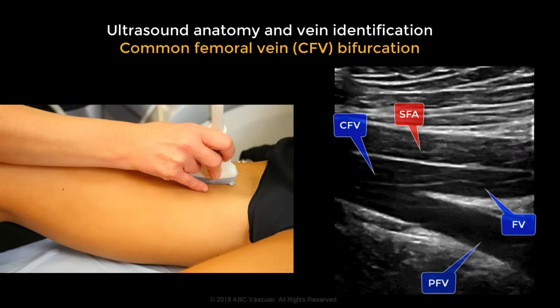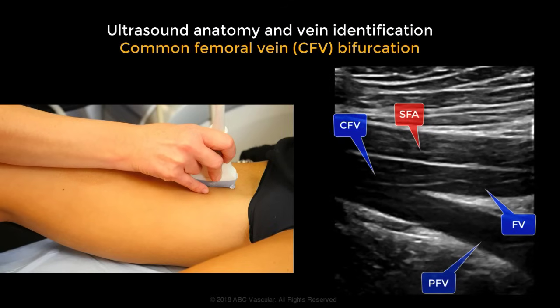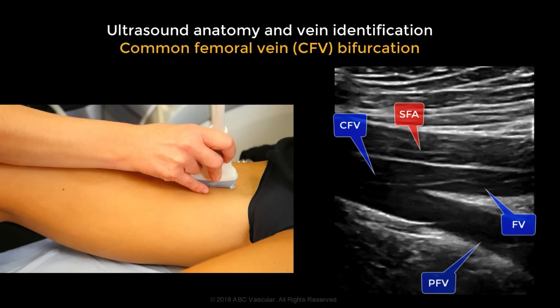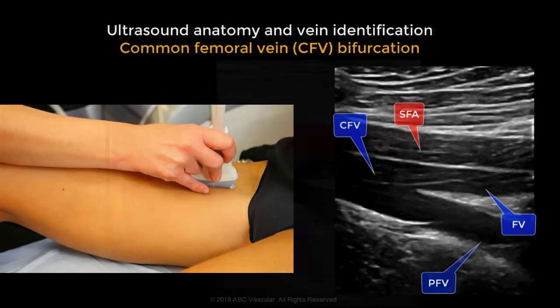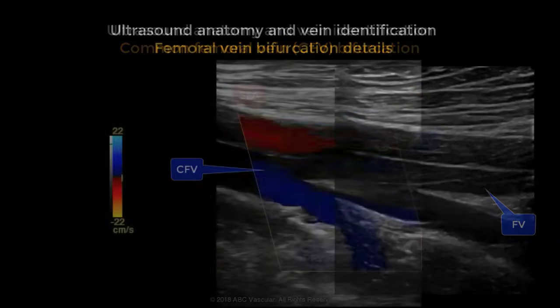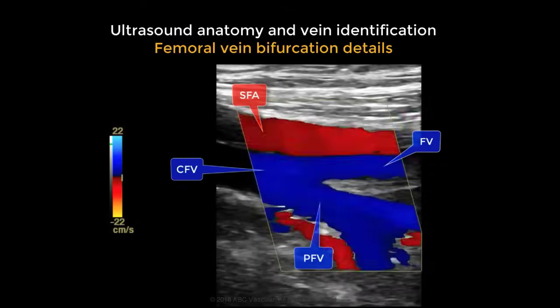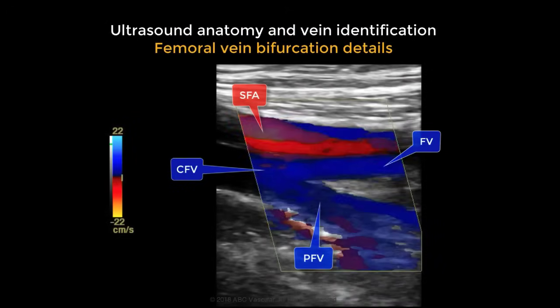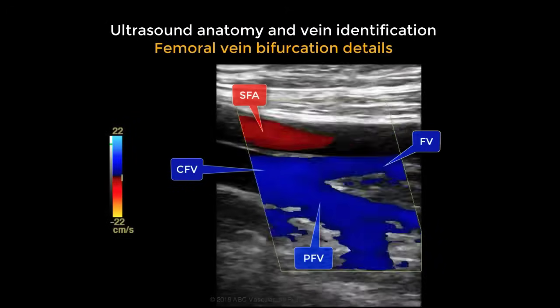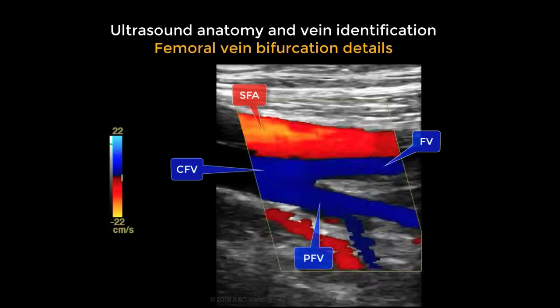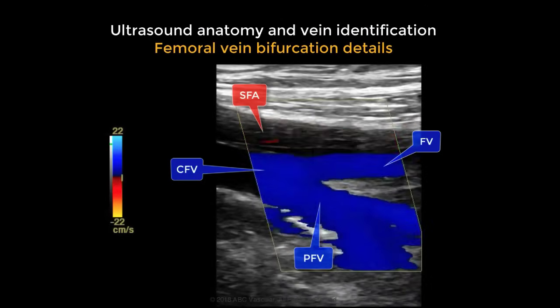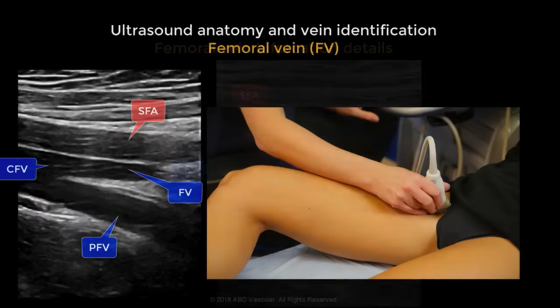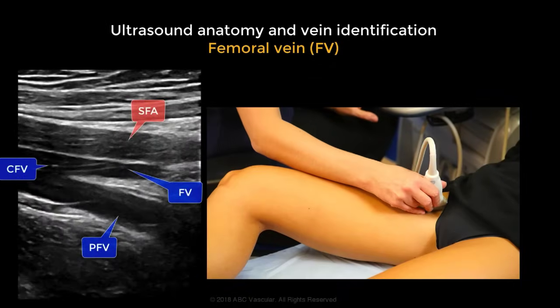You can see that the arterial bifurcation has already divided, and the common femoral vein is just posterior to the superficial femoral artery. You can probably better appreciate this using colour flow. Note that the venous femoral bifurcation is more distal compared to the arterial bifurcation.